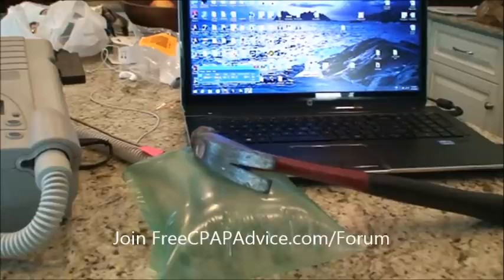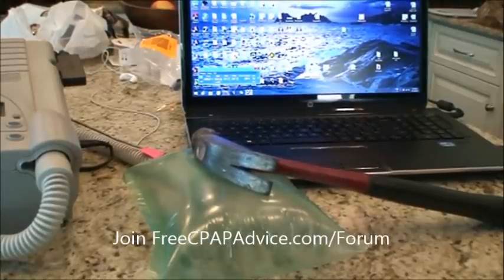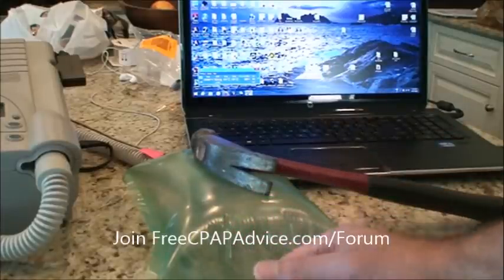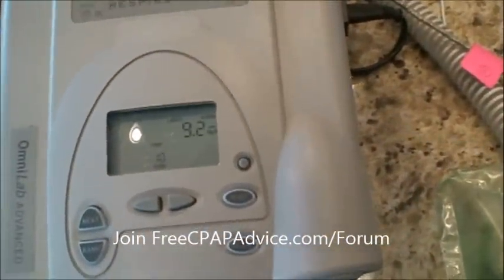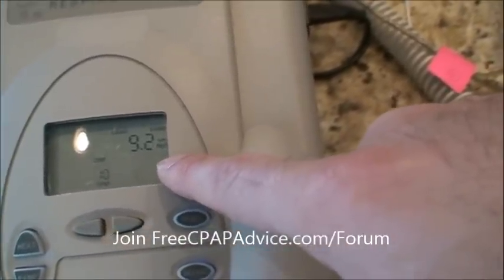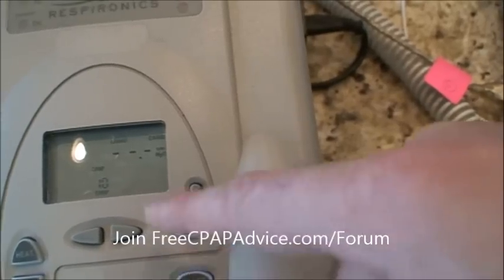All right, so now our leak has jumped up almost to, it's going up to 80, 85. Okay, now in a lab, that would be considered like the worst leak ever. Okay, so now we can see that the machine is supposed to be blowing at 10, but it can't keep up. There's too much leak. It's actually only getting 9.2, 9.3. But now it just cut off.